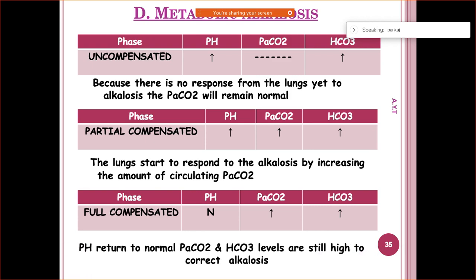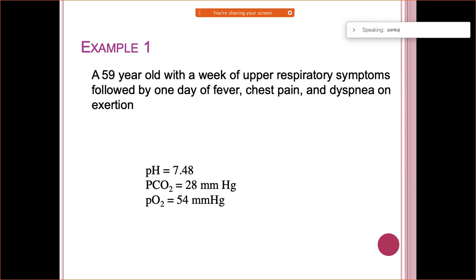So in the initial stage, the counterpart is the key to look out for. For example, if it was metabolic acidosis or alkalosis, in which you were trying to look at the bicarb, you have to look at the PaCO2. If you are able to look at that, and later on you see the normalization of the pH, bingo, you are done. Okay, solving problems is one of the really, really important things, especially in this. So we are trying to give you some examples. Try to think about this clinical case scenario.